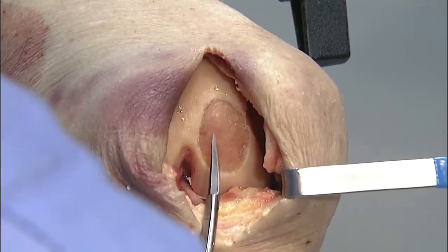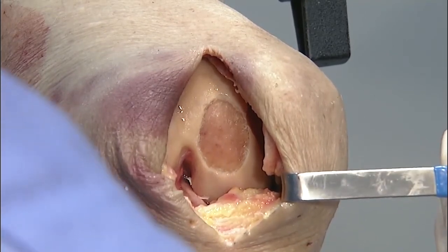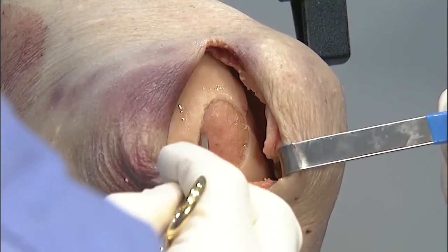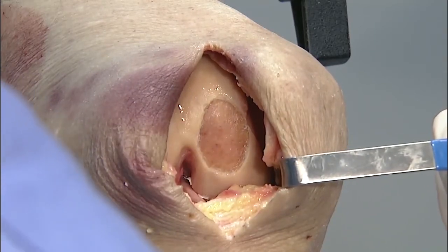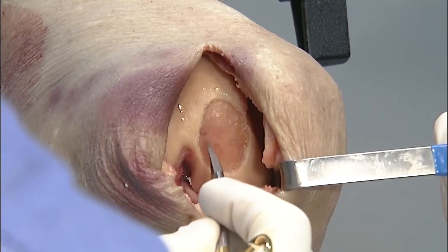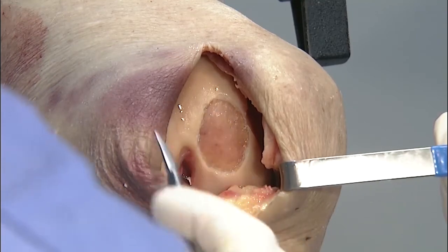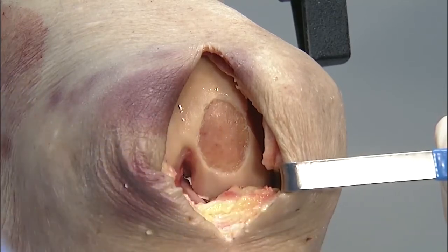Here, what you want to do with ACI, which is classically taught, and MACI, is you want to radically debride all diseased cartilage with full thickness fissures, etc. If you think about the cartilage integration, you want it to integrate to nice, healthy surrounding articular cartilage. I'd be worried about putting this implant up against cartilage that's still diseased. Lars Peterson did some nice work showing that, if you have the cartilage lesion, you have this kind of penumbra zone where you still have some apoptotic cartilage cells, and it's about a 2 millimeter rim. So in general, I try to clean at least a millimeter beyond what I see as diseased cartilage.